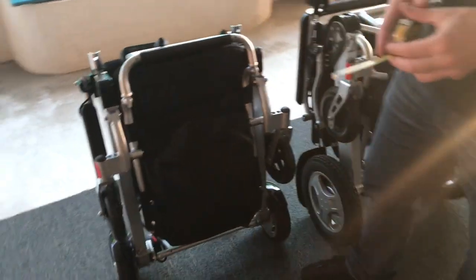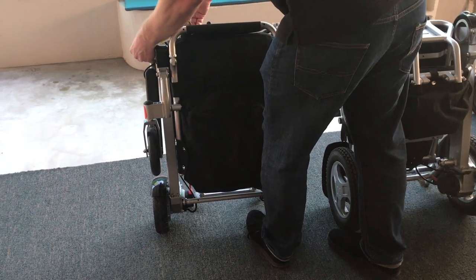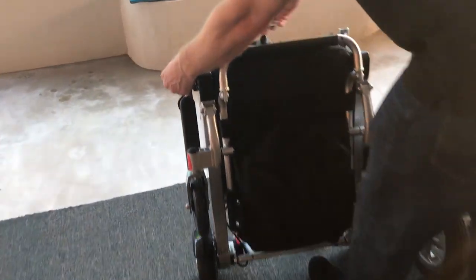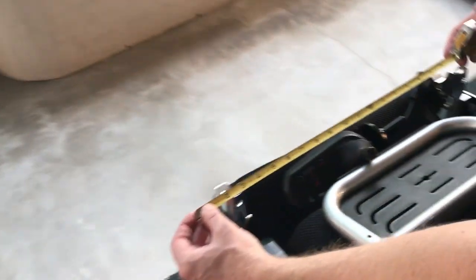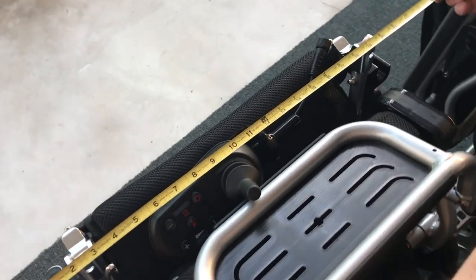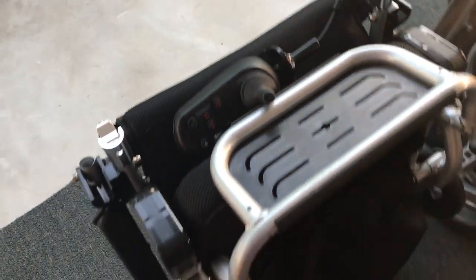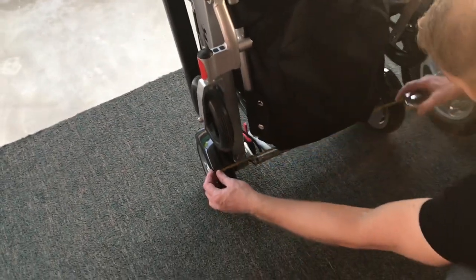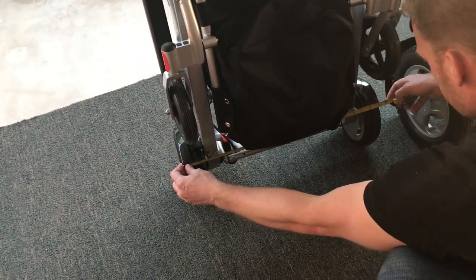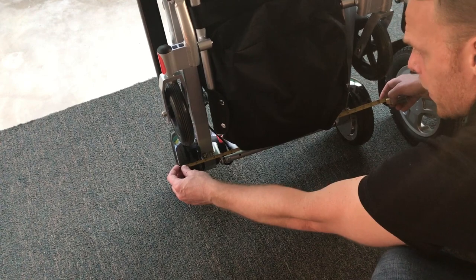For the Air Hawk power folding wheelchair, let's get started. We take this tape measure, put it on the outside arm, and we're looking at about 22 to 23 inches — we'll call it 23 inches. Then going down to the outside of the caster to the outside of the caster, we're at a little bit over 23 inches.